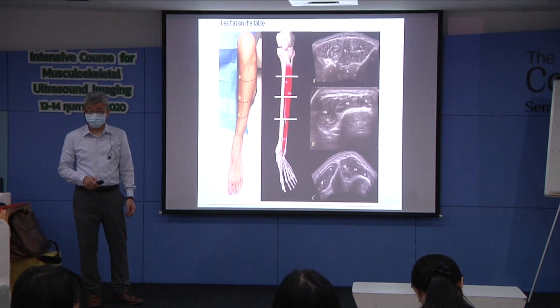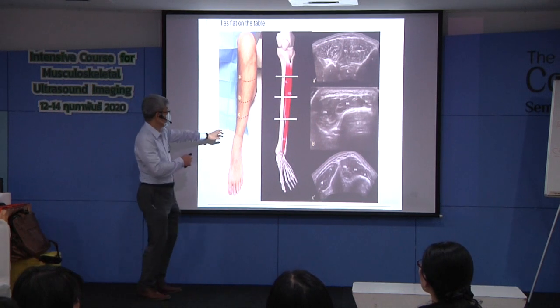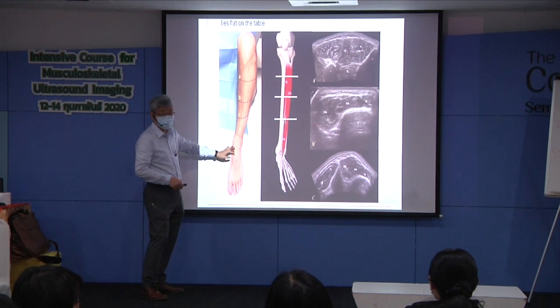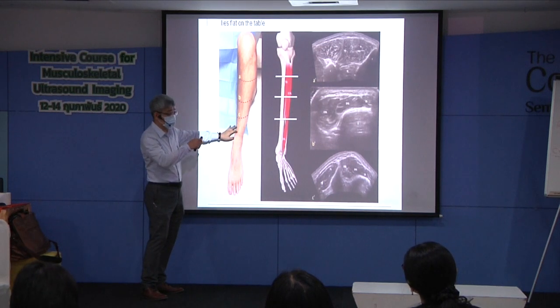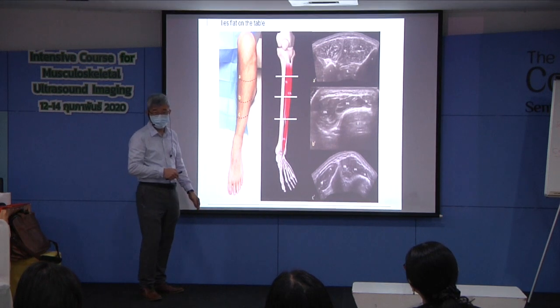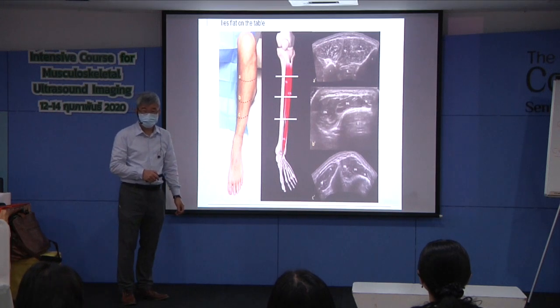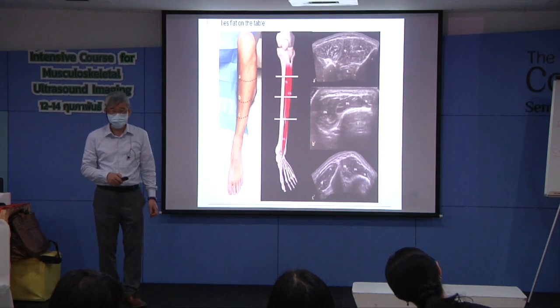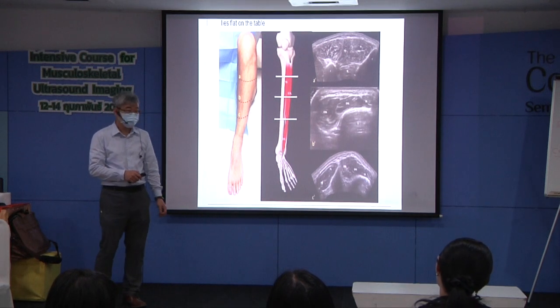So the level 2 lectures is not look at this level. The level 2 will be moving the probe around upwards, downwards, lateralwards, medialwards, and to see anything connected to each other and close to each other. And you have to know what you are looking for and make the preset change necessary, if necessary.